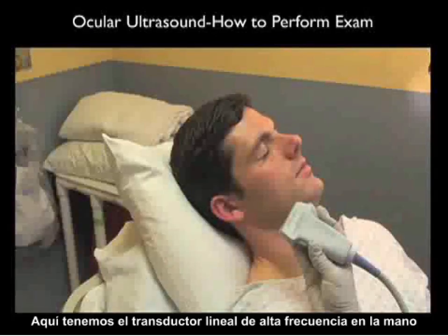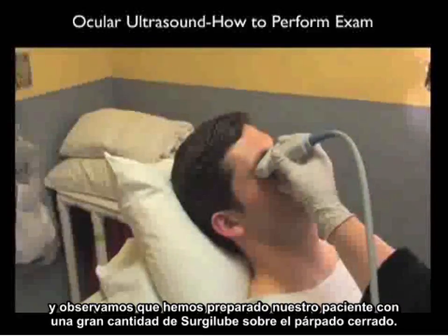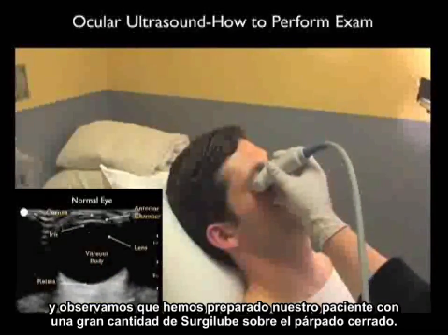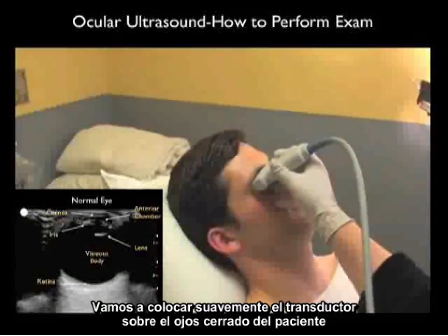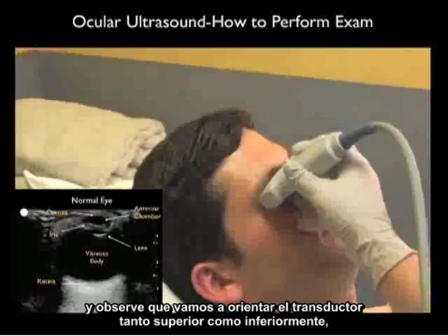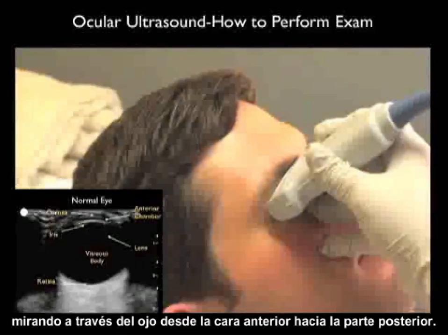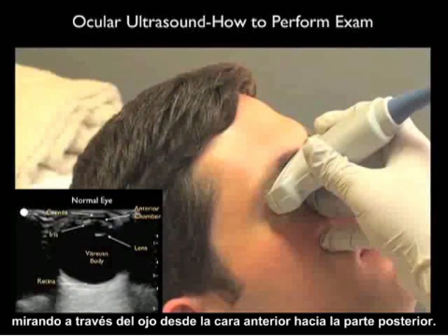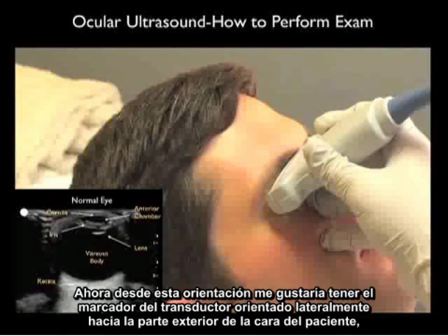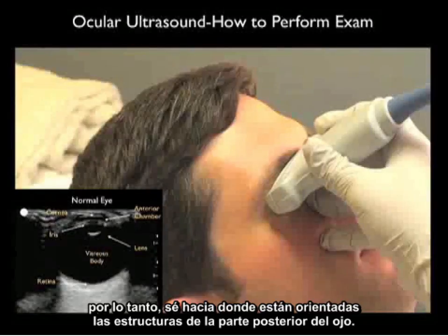Here we have the high-frequency linear type array probe in our hand, and note we've prepared our patient with a copious amount of Surgilube on the outer part of the closed eyelid. We're going to gently place the probe over the patient's closed eyelid, scanning through the eye, and note that we're going to orient the probe both superior and inferior, looking all the way through the eye from the anterior aspect down through the posterior part. From this orientation, I like to have the probe marker oriented laterally towards the outer part of the patient's face so that I know where the structures of the posterior part of the eye are oriented.